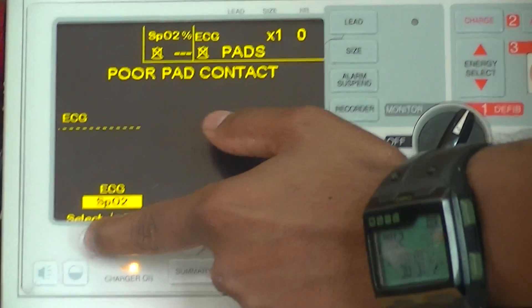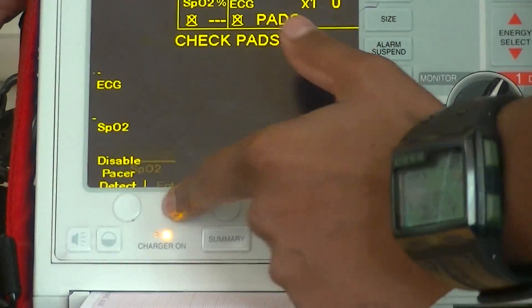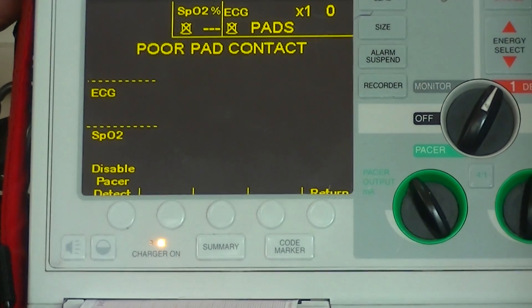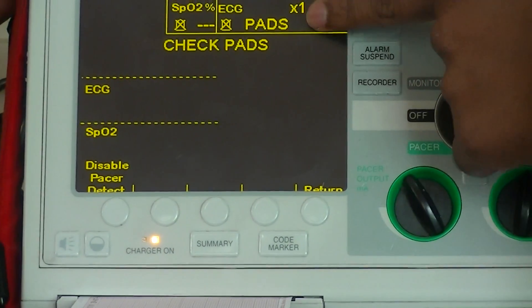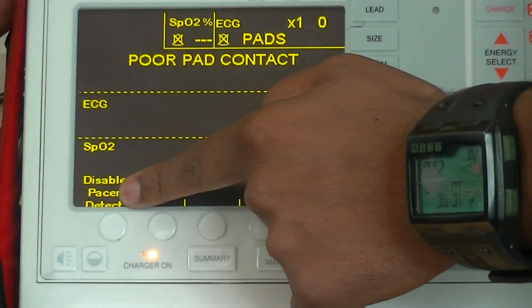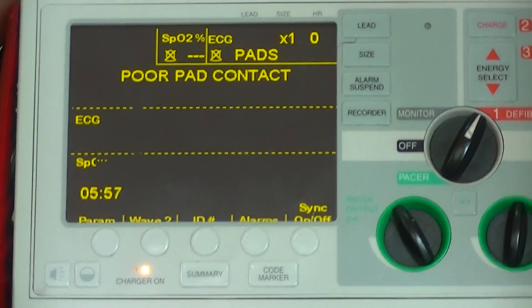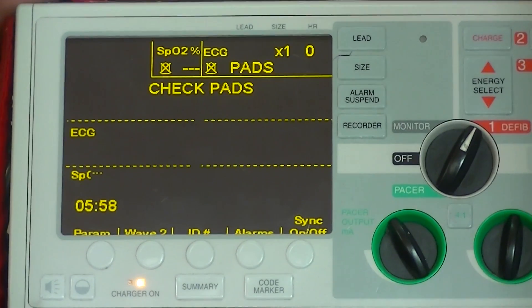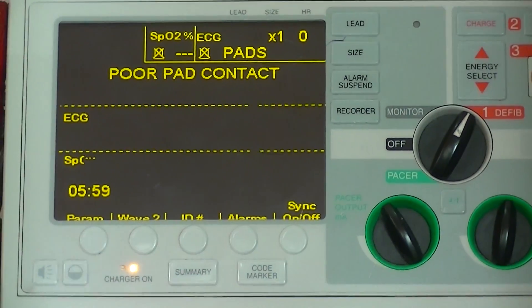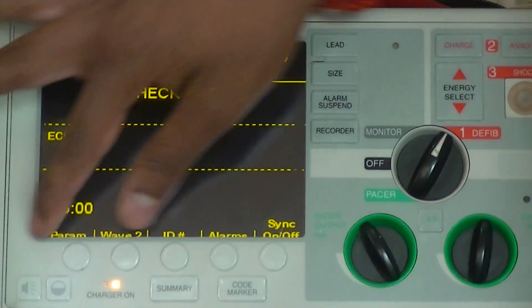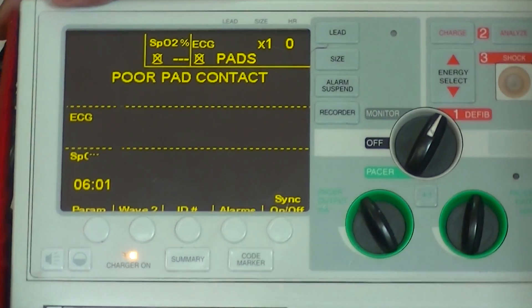For the ECG, selecting it gives the option to disable pacer detection, which needs to be disabled. That's all about these soft keys — they will keep changing based on what is needed.